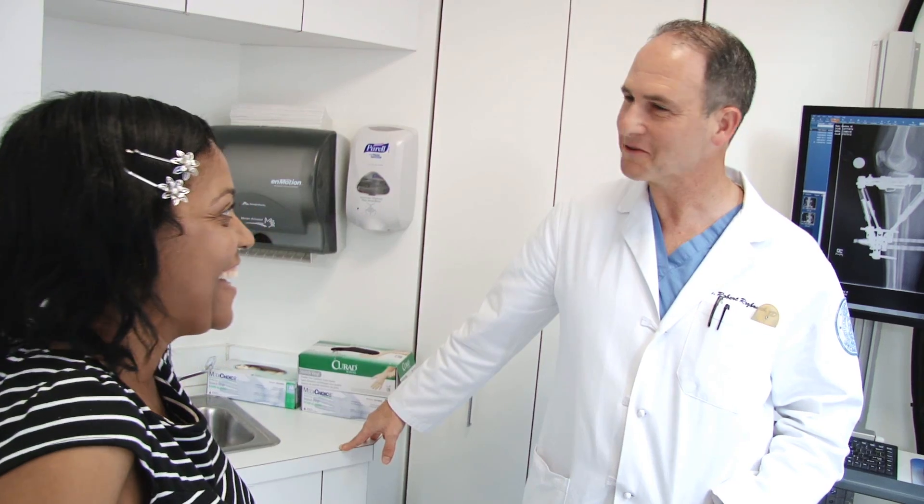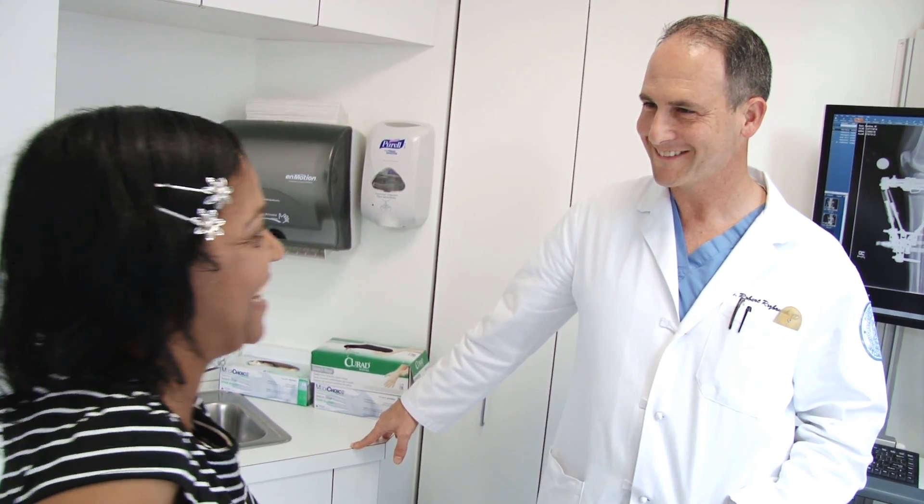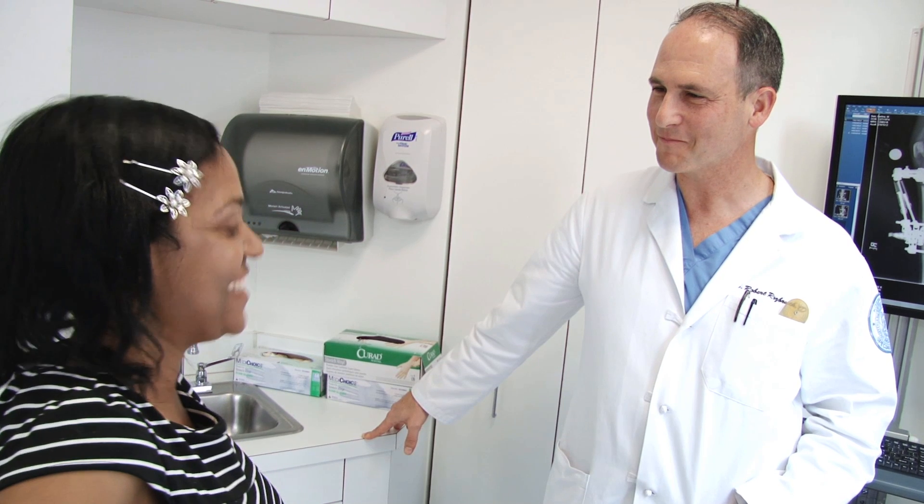This bone cut, done through a very small incision, is what's going to fill in gradually over time. You're doing a great job — everything's looking perfect. You did a great job. I never really thought I could get this fixed — we make a good team.